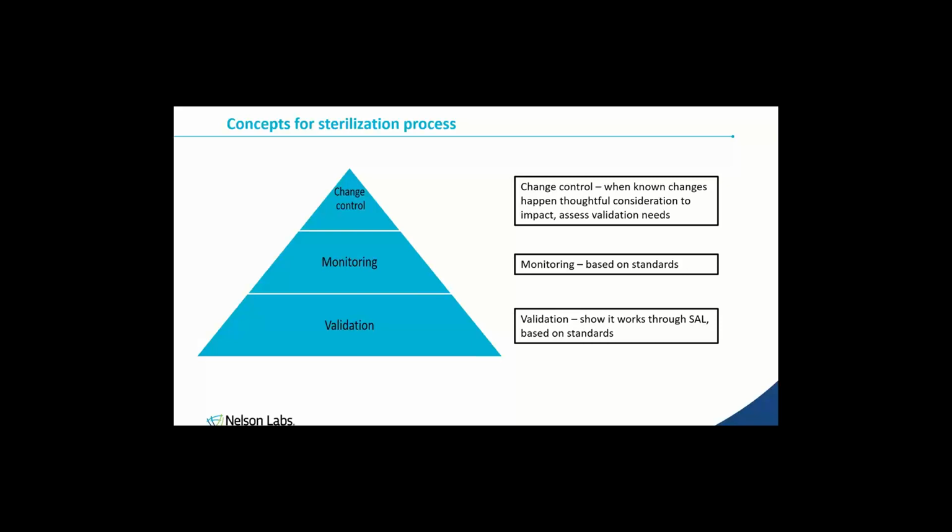So concepts for sterilization is that really the bulk of the work that we do when we do sterility testing is going to be for validation purposes. So it's being used to show through a validation that a particular SAL, or sterility assurance level, has been achieved.